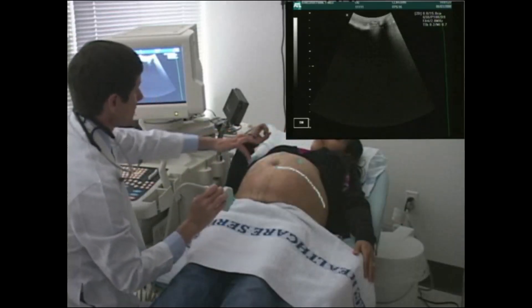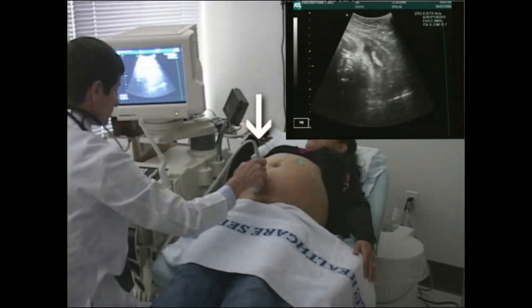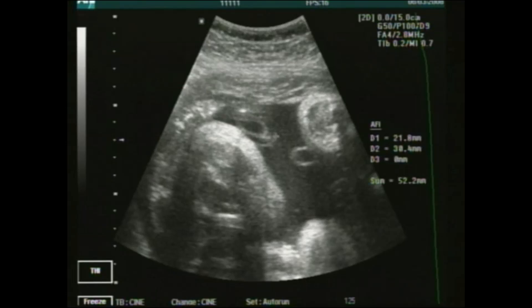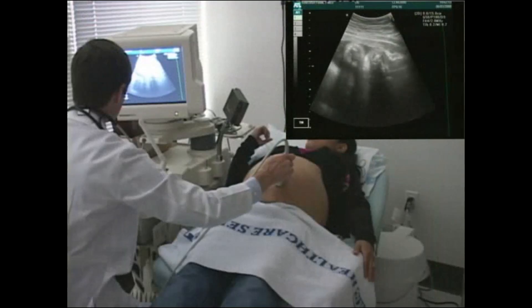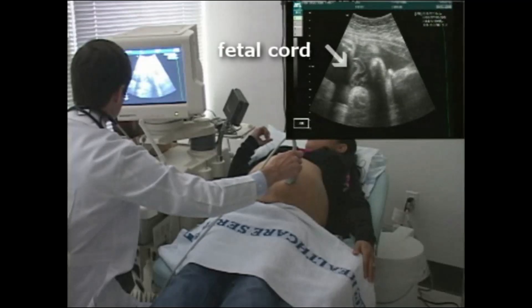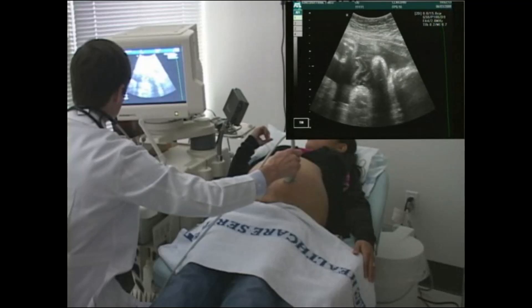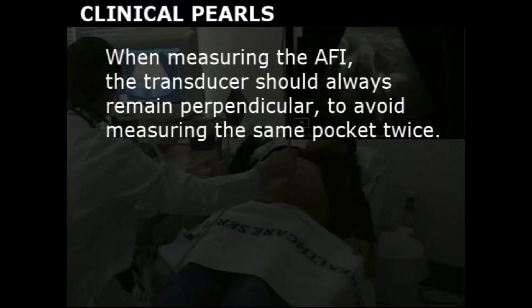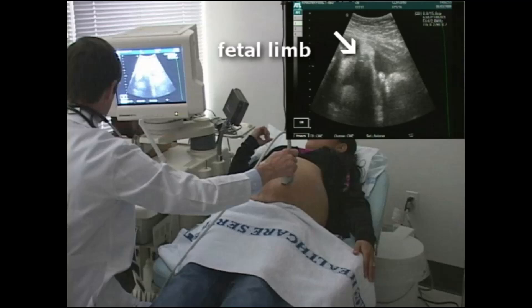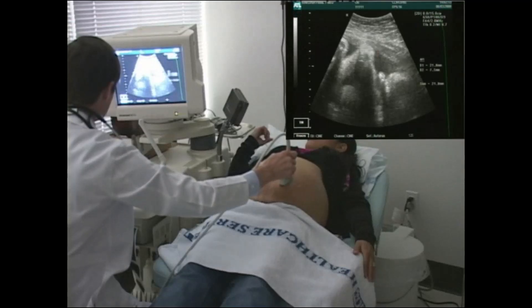Divide the uterine image into four quadrants, measured on the maternal umbilicus. Hold the ultrasound transducer in a vertical alignment. Starting in one quadrant, identify the pocket of fluid with the largest vertical dimension. Measure the pocket size and record the findings. Take care to avoid including segments of the umbilical cord in the measurement, as a coiled cord can fill the space and appear to be fluid. Repeat this procedure in each quadrant. When measuring the AFI, the transducer should always remain perpendicular to avoid measuring the same pocket twice. Find the deepest vertical pocket in each quadrant that does not include fetal limb or the umbilical cord. Sum the measurement values from all four quadrants — this total is your AFI.